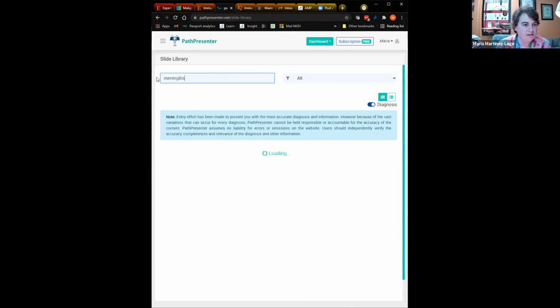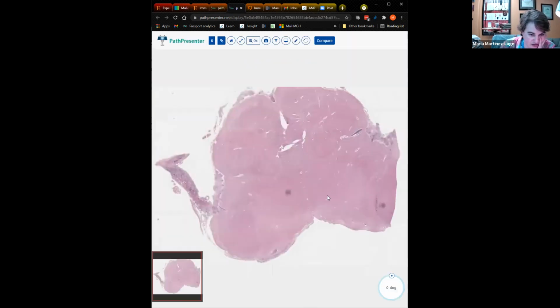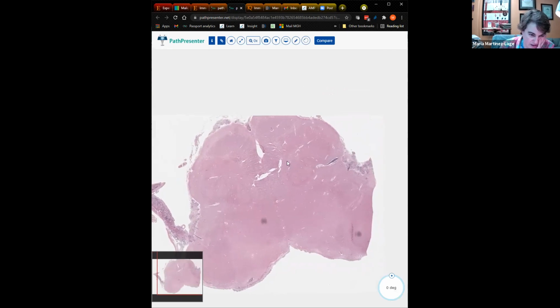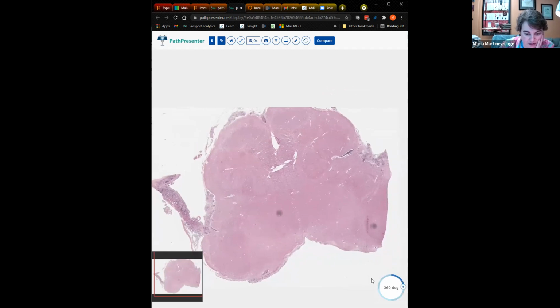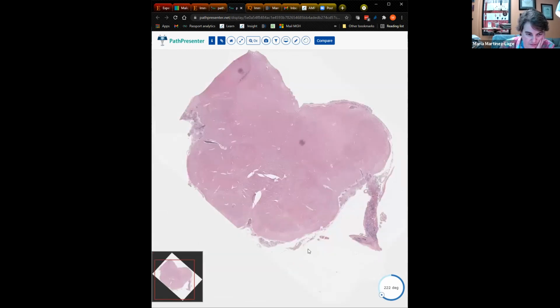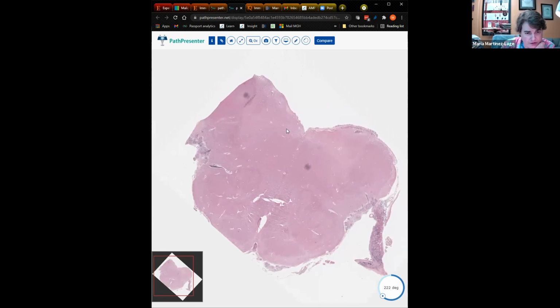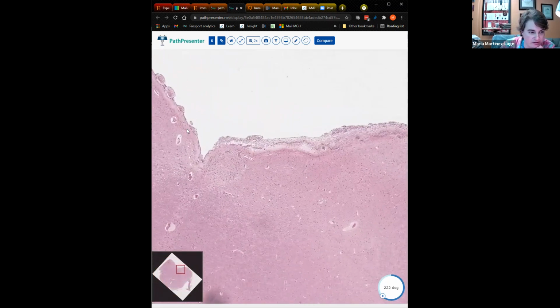Are there any other meningitis here that make sense to visit? Let's see. Here is a section of the medulla, from an autopsy. Okay, so this is the floor of the fourth ventricle here. These are the pyramids all the way here, and these are the inferior olivary nuclei. It's an H&E stain. The first thing that I can see on low power is that there are a few areas in the meninges that are dark and quite blue. One here underlying the ventricular surface.